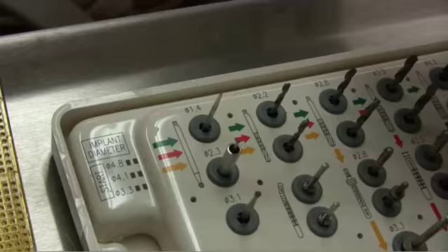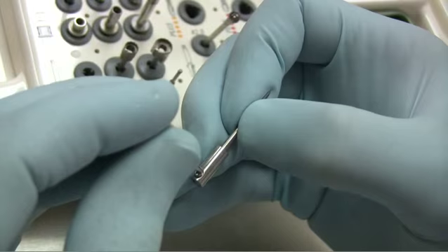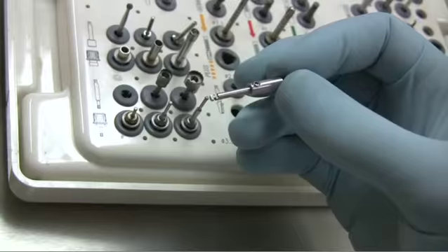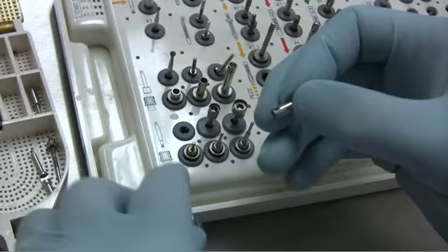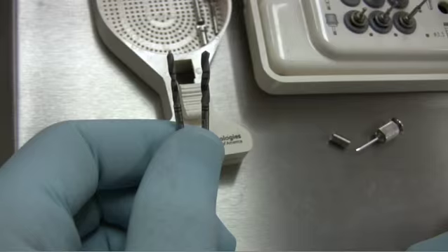These screws are extremely small and care must be taken when using them. Only a 050 driver can be used with these screws — any other size will cause stripping of the screws and then prevent the stops from being secured to the drill shank. All of the drills have the same shank size but different cutting diameters. The stops are available for short and long drills with markings to indicate limiting depth. The stops can slide from the top to the bottom on the 2.2 drill and can be inserted from each end. As the drill diameters increase, the stops can only be placed on the burr from one end.